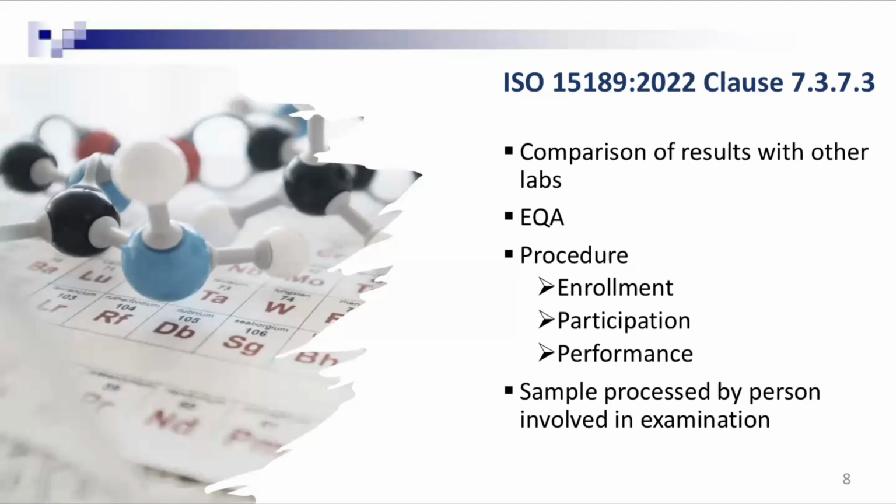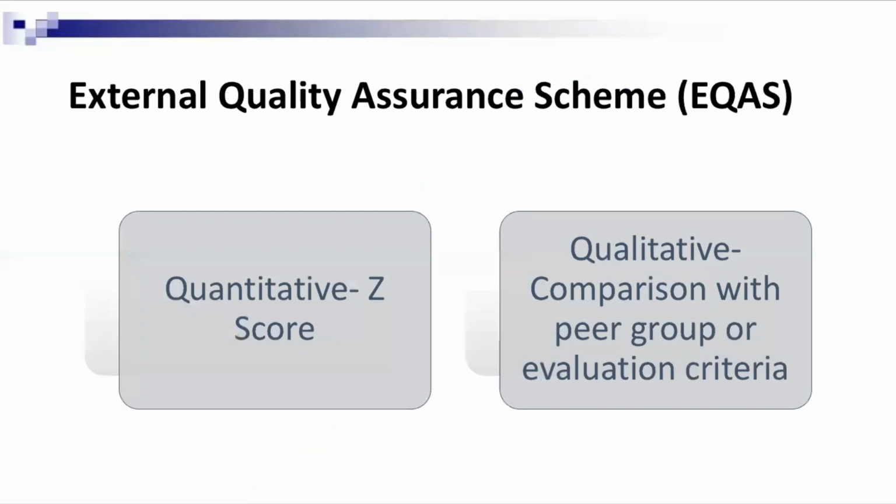And it is important. What is the purpose of participating in EQAS? We want to detect an error in our analytical system. So this EQAS sample shall be processed by the same person who is performing patient testing. It is not that you say, this senior person will perform this EQAS test, while all the patient samples are analyzed by some other person. This way you will not be able to detect the error in your analytical system.